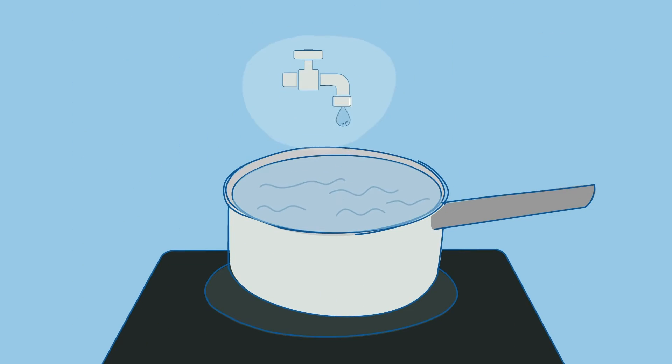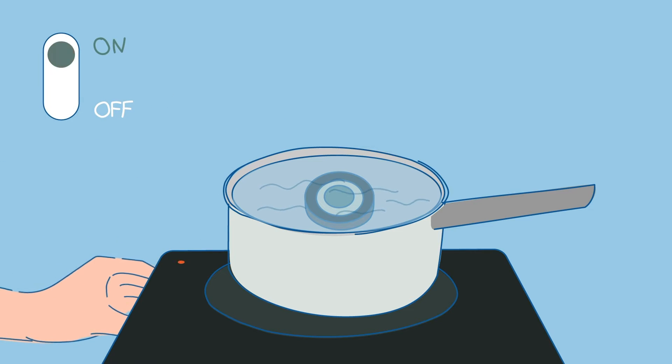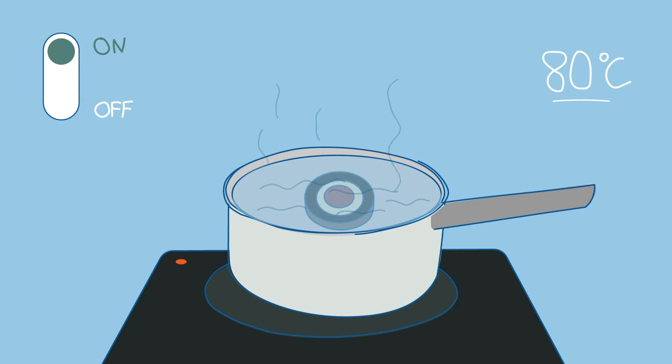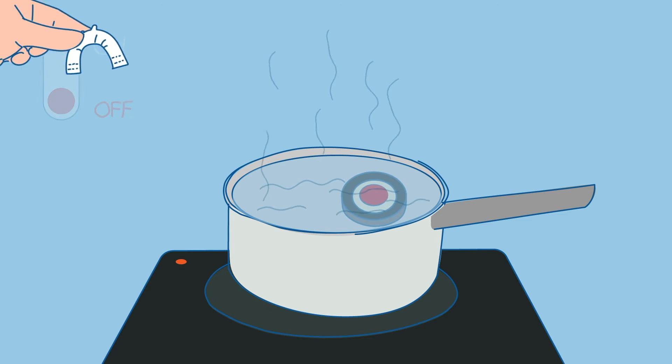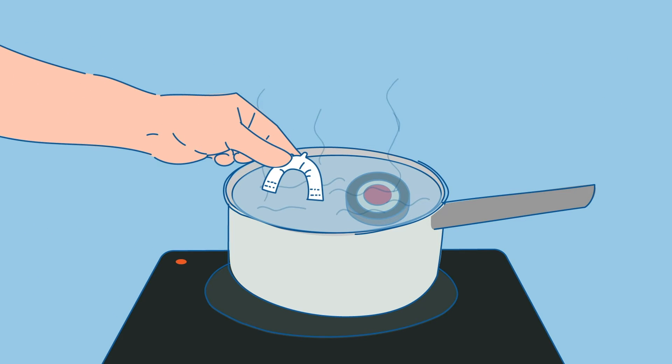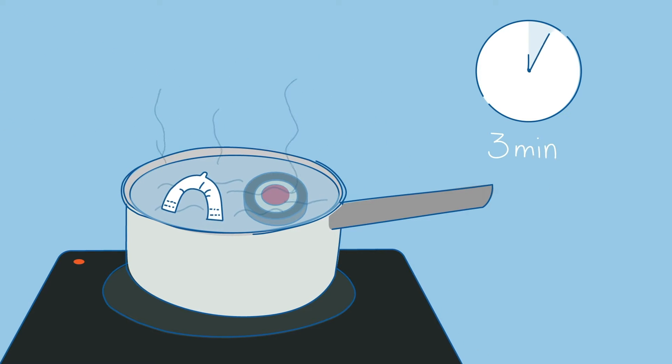Heat a pot of water with the temperature indicator until it changes from green to red, once the water reaches 80 degrees Celsius. At that point, turn off your hot plate. Then plunge the upper mouthpiece, identifiable by its single hook. Wait three minutes.